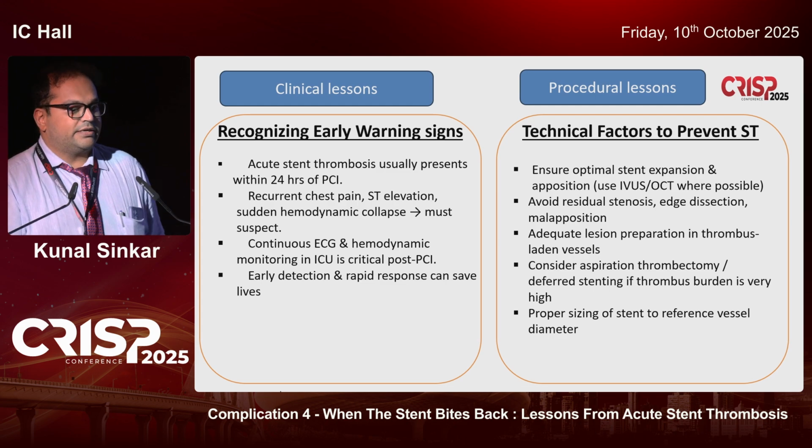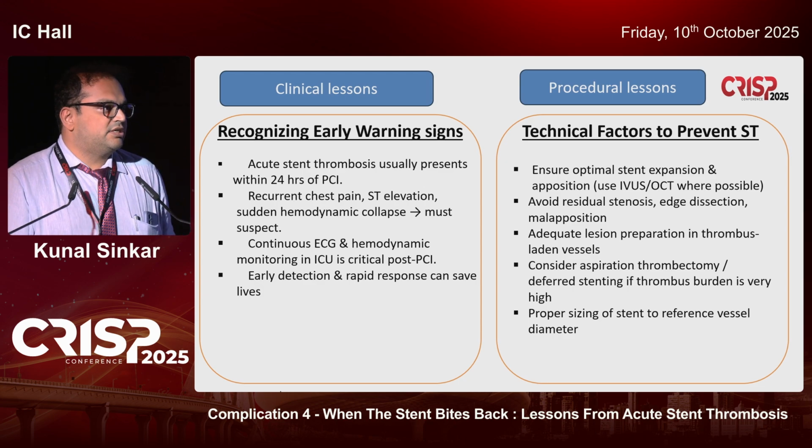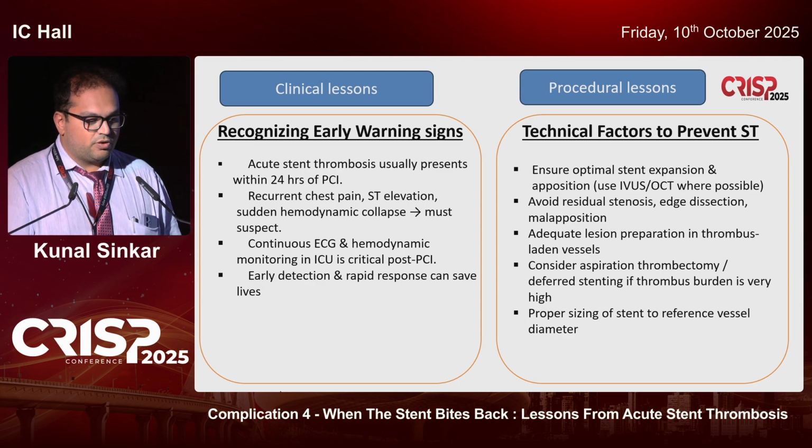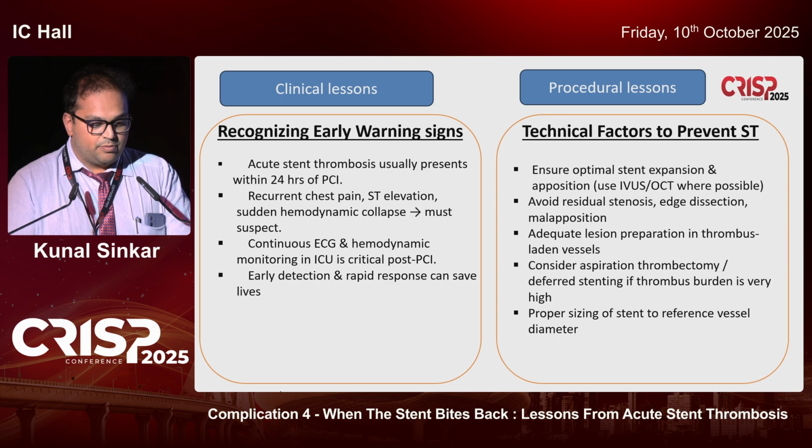Possible lessons to learn: recognizing the early warning signs. Acute stent thrombosis usually presents within 24 hours. ST elevation and sudden hemodynamic collapse must always raise suspicion of acute stent thrombosis. Continuous ECG and hemodynamic monitoring in the ICU is critical post PCI, and early detection and rapid response can save lives.